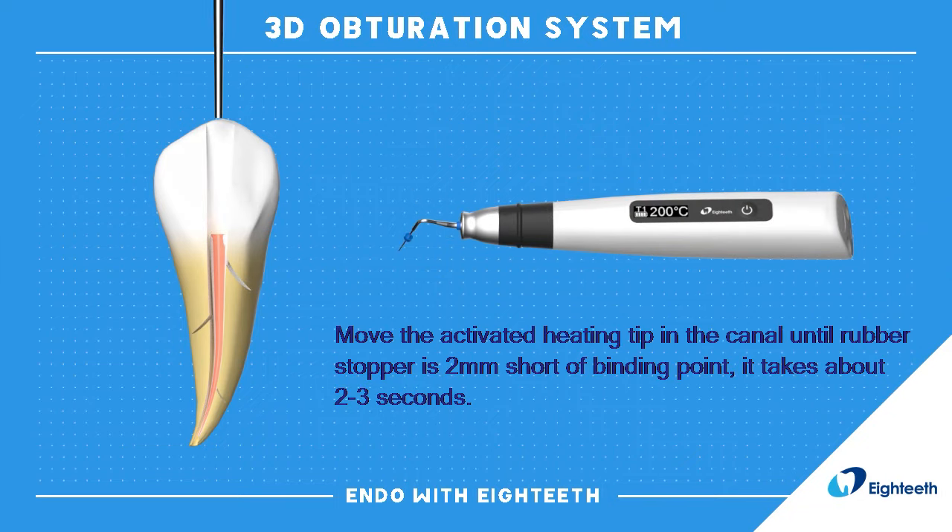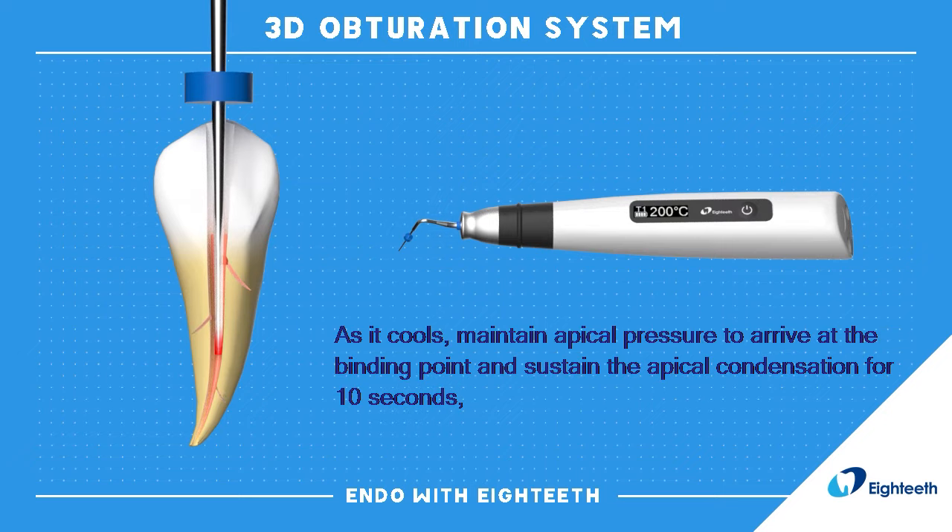Move the activated heating tip in the canal until the rubber stopper is 2 mm short of the binding point. It takes about 2 to 3 seconds. As it cools, maintain apical pressure to arrive at the binding point and sustain the apical condensation for 10 seconds.